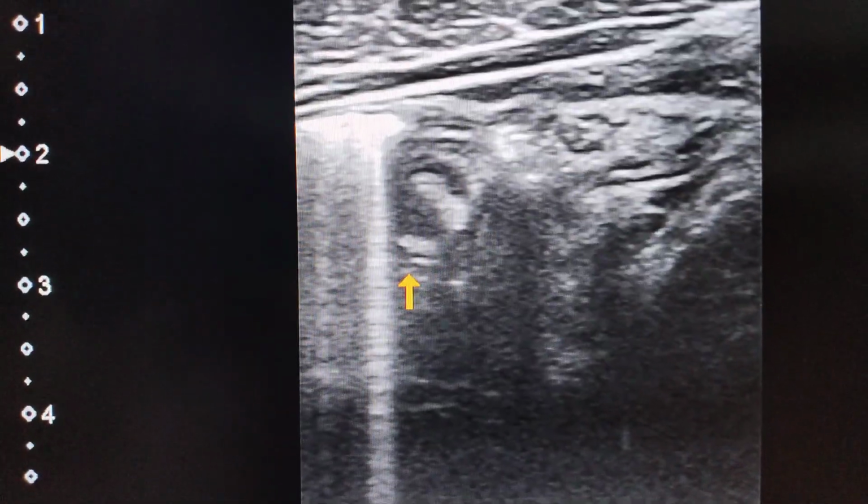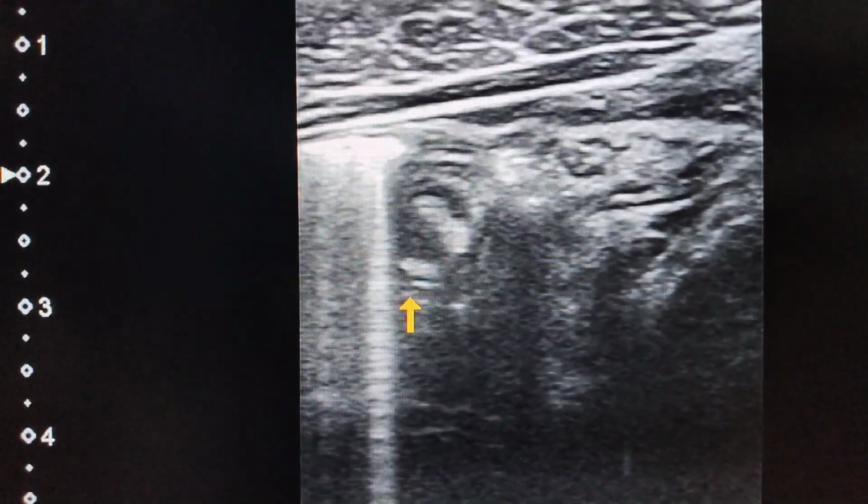So now I am going to highlight it further.